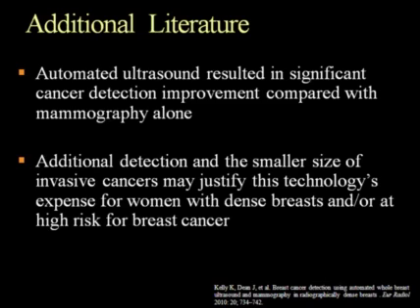So these authors clearly understand that it's helpful. It may find additional small cancers that will not be perceived for years, possibly, until they're larger and more serious. But they do realize the expense to healthcare that this device may cause, as screening ultrasound currently is not covered by most insurance companies, and that may be a cost that the patient may have to take on.